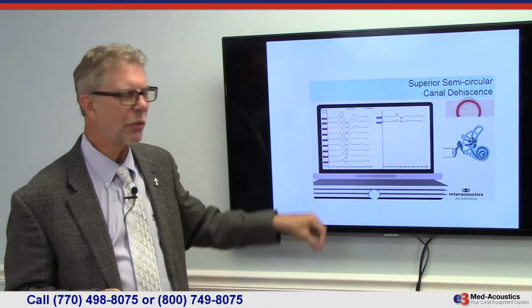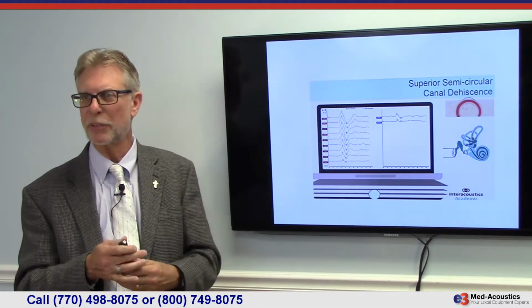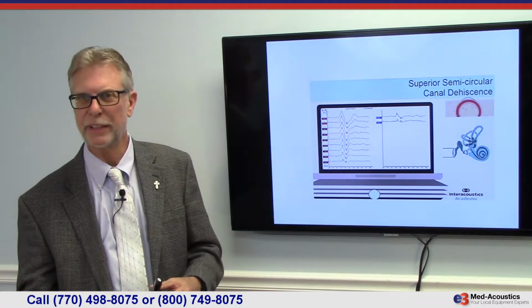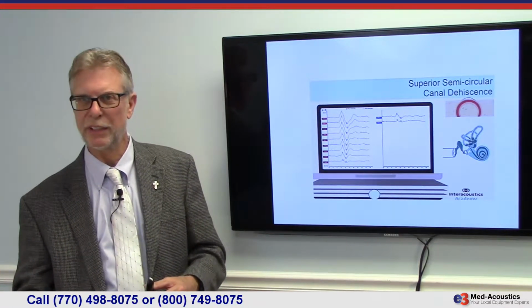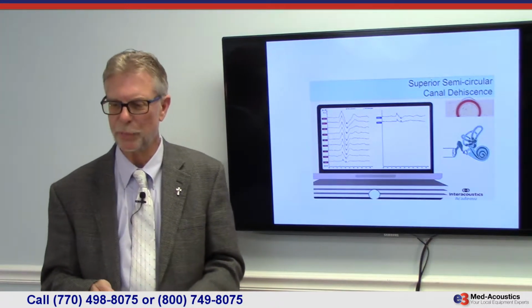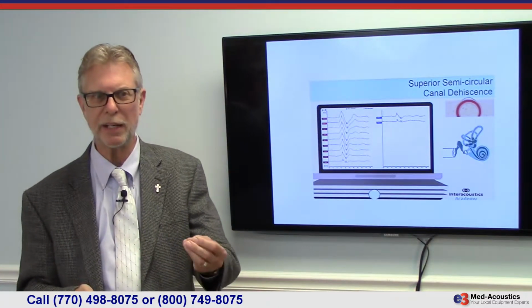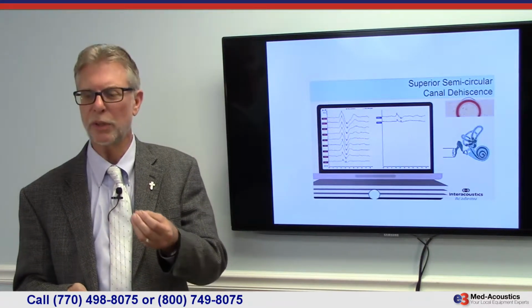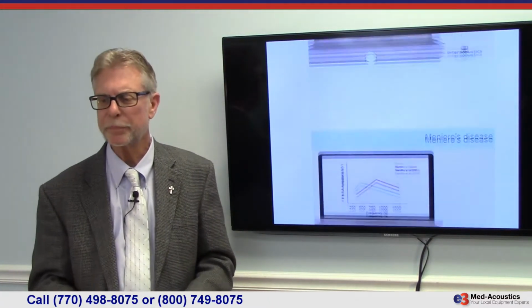Also, when you do threshold, instead of the threshold being 85, 90, it certainly could be down there at 60, 65, right? A reduced threshold for the response. So that will help identify superior canal dehiscence. This is the defining test for superior canal dehiscence.